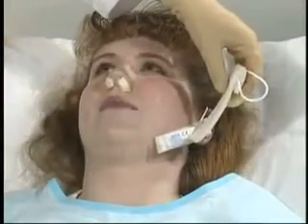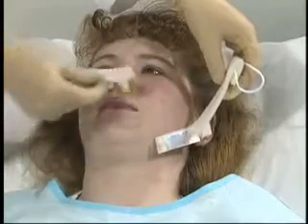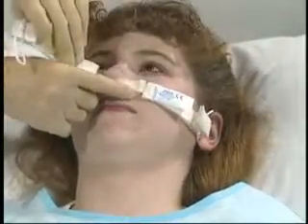The nasal dressing holder is latex free and made of soft, comfortable materials and is totally adjustable. One size fits all patients.